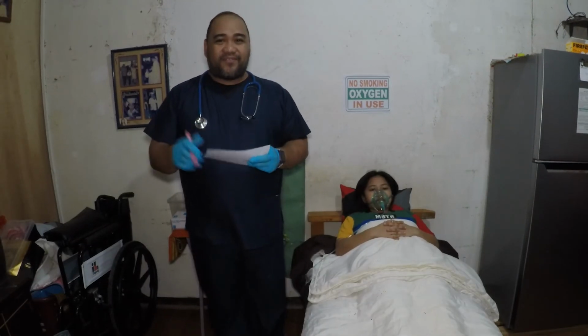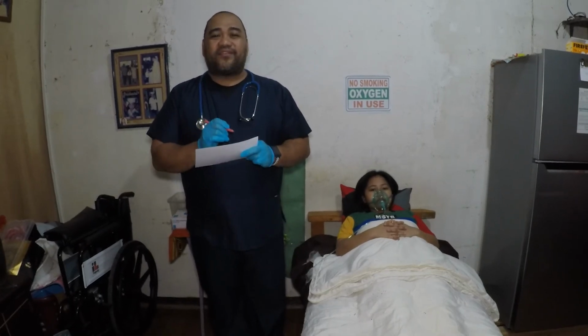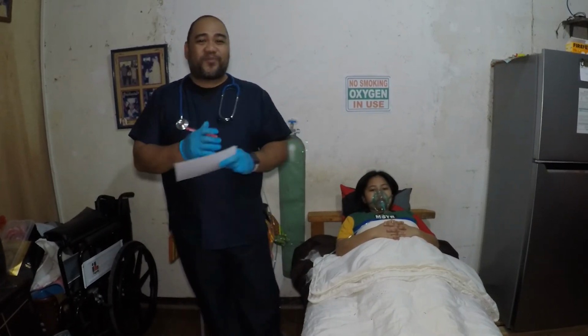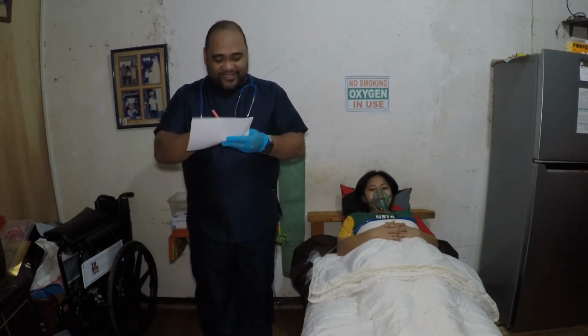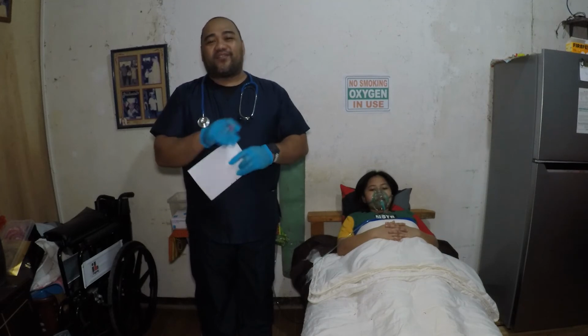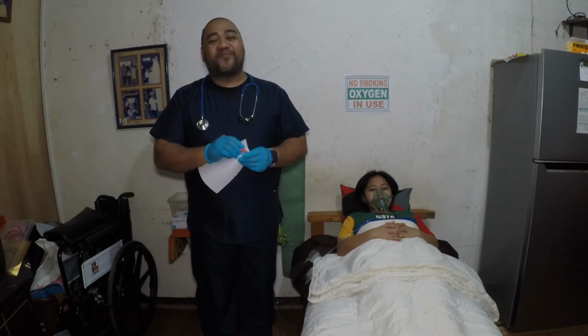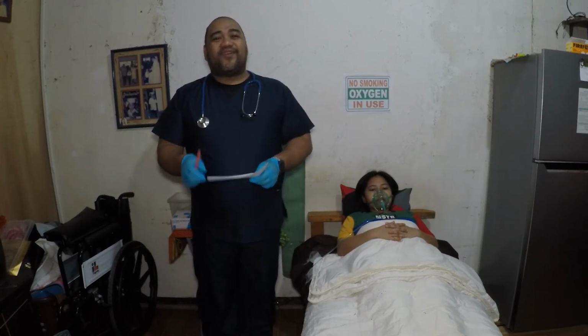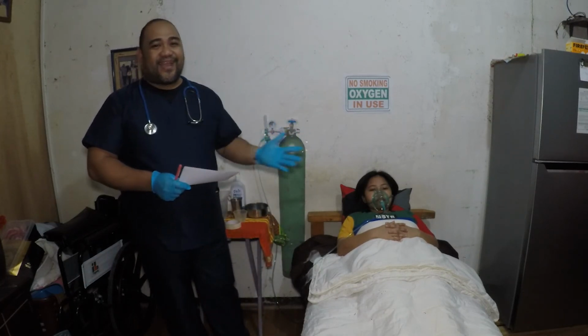We have also to document the following: the date, the time, the method, the flow rate, the respiratory condition, and response to oxygen. This is to provide proper coordination of care, since we know that oxygen inhalation can bring oxygen intoxication. And we have to sign the chart to maintain professional accountability. Then report to senior staff to provide continuity of care and confirmation of the client's condition. And also check the oxygen setup, including the water level of the humidifier, clean the cannula, and assess the client's status at least every few hours. Monitoring the water level is really vital.